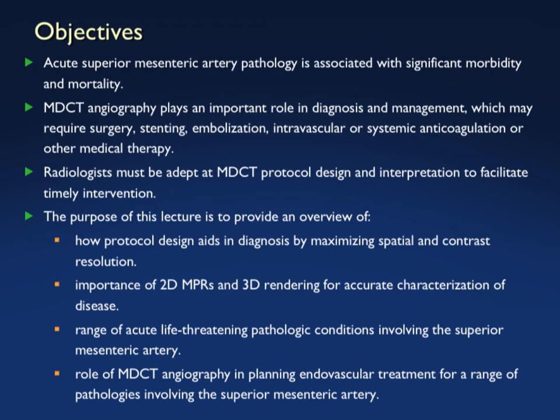CT is the ideal study for looking at the SMA and helping plan whether patients need surgery, stenting, embolization, or other therapies. A critical part of looking at the SMA is that looking at the axial images is not enough. You need to look at the sagittal views on every single case — we've spoken of that in regard to the celiac axis and to the SMA as well as the spine.